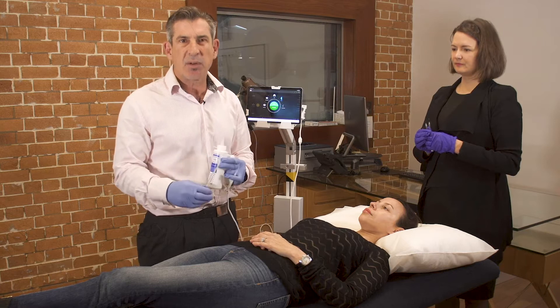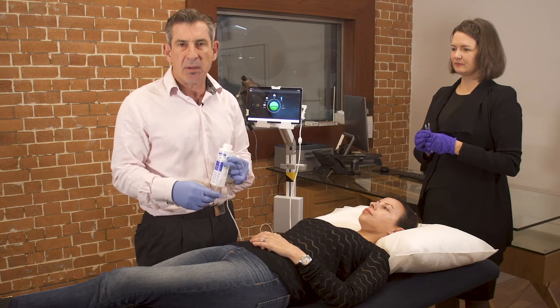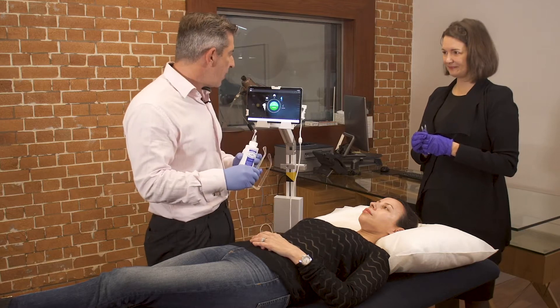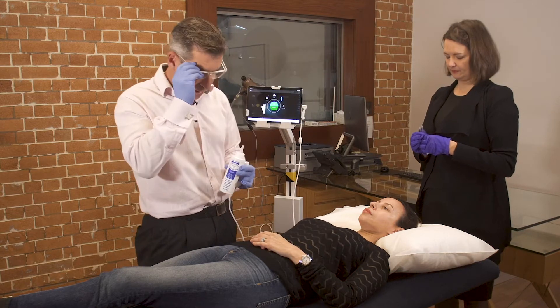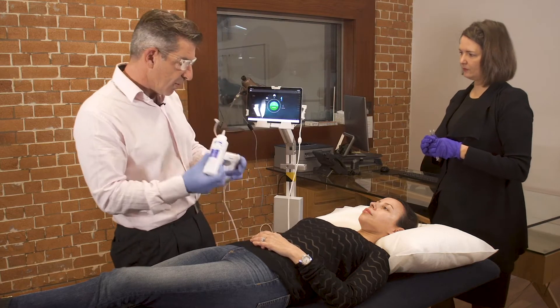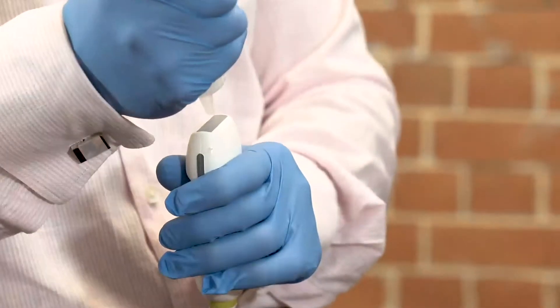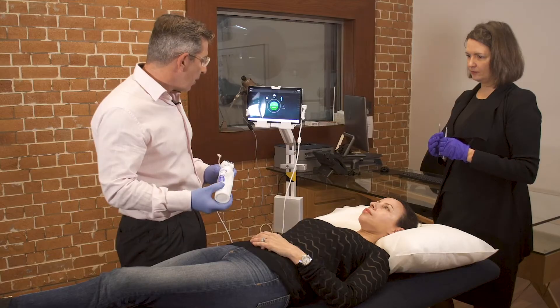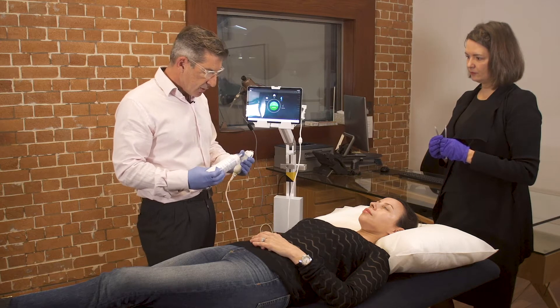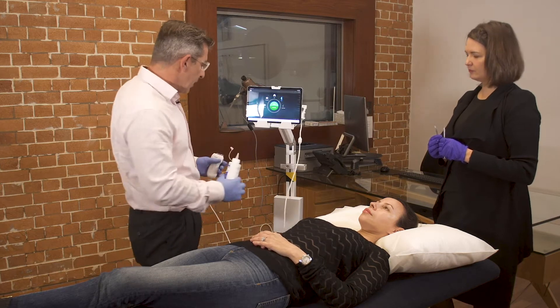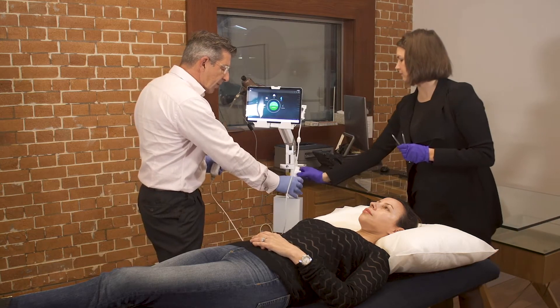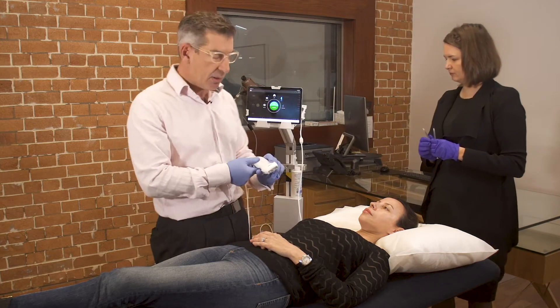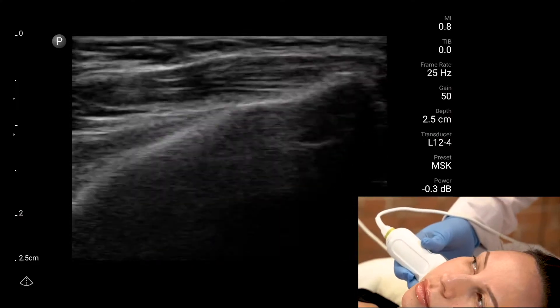This will be done under ultrasound guidance with the assistance of Dr. Wills. We'll be using a device called a Lumify, which is a handy little office ultrasound. We apply some ultrasound gel and then I will gently locate the muscles on the patient and inject some botulinum toxin that I've previously drawn up.